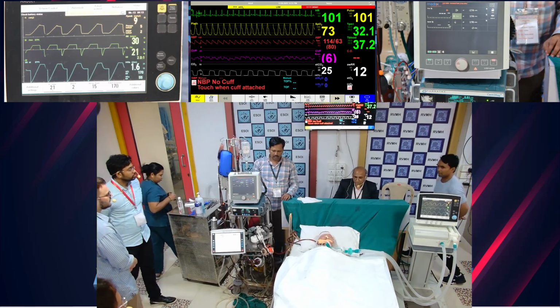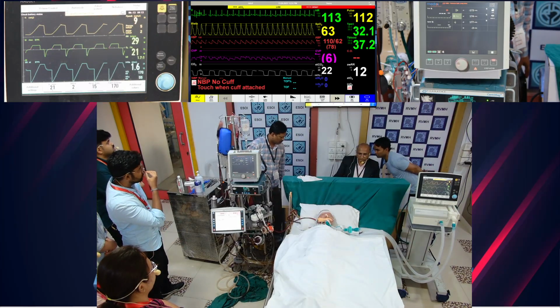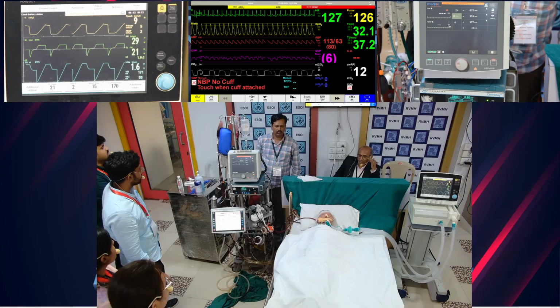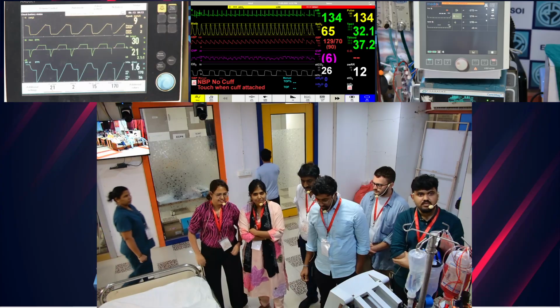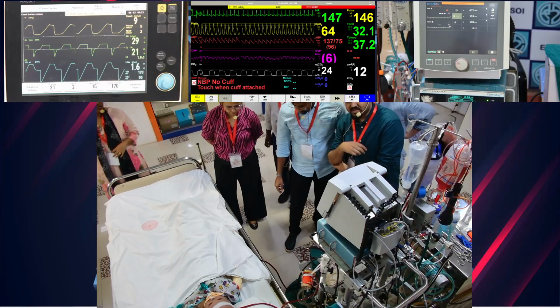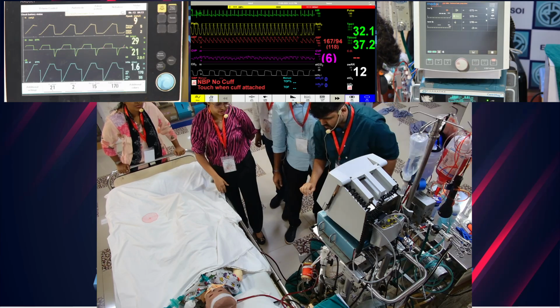Any lactate level, sir? Excuse me, sir, the patient is desaturating on the monitor. Speak a little loudly so that everybody can listen. The patient is desaturating, tachycardia. We'll take on the emergency vent. Tube colors, sir: are they the same, or have they changed? The P1 pressure is also becoming more negative. The tube colors I don't see a difference; both tubes are the same.